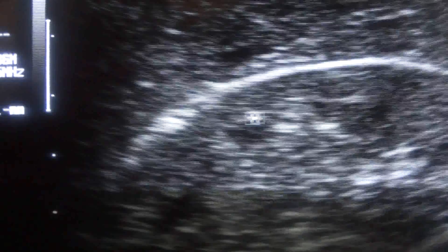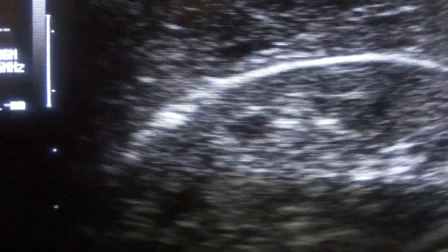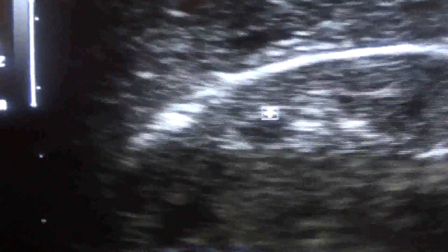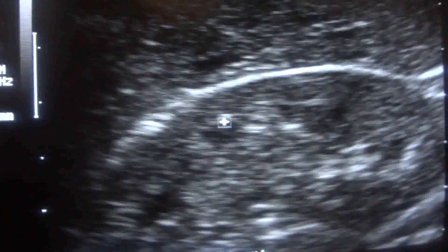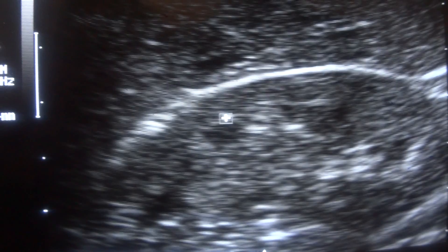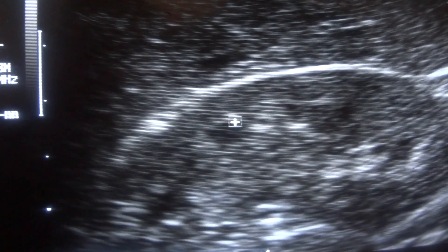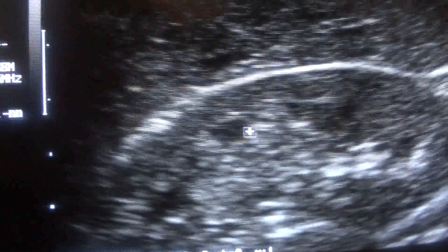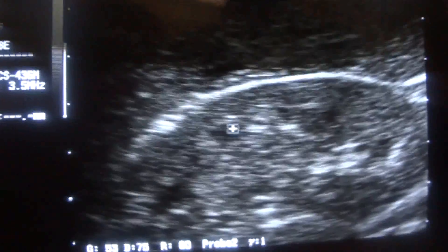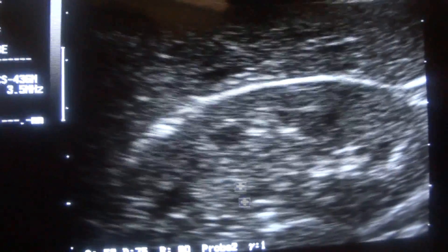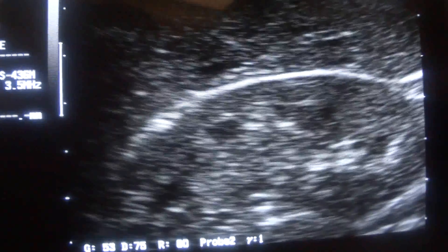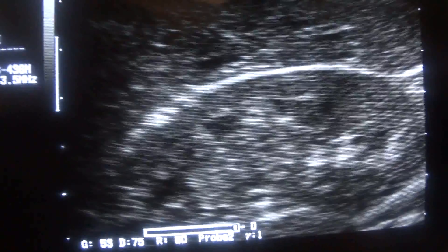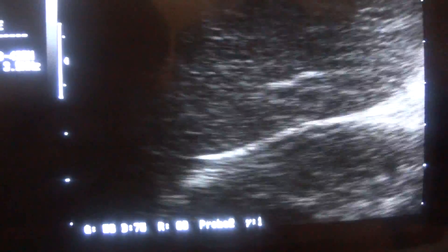At times, when these are too prominent, they are labeled as calculi. Be aware that this is the arcuate vessel and not a calculus or calcification. This is the pyramid, not a cyst — a medullary cyst should not be labeled in such situations. Be aware of these facts.